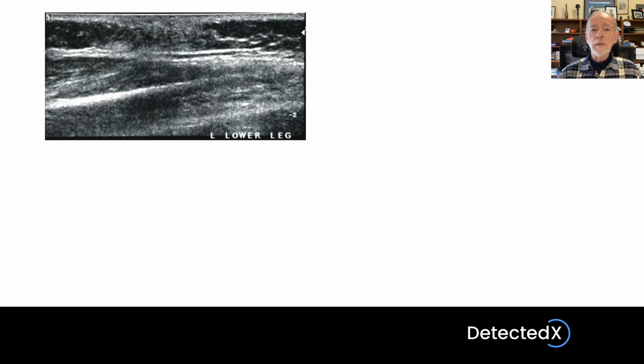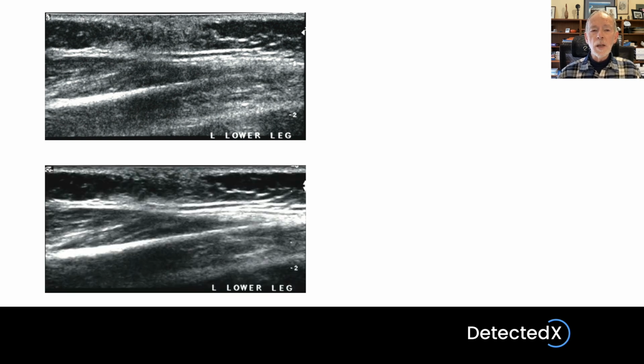Here is an image of a leg. The upper image is a conventional or simple scan, and the lower image is the compound image. You'll notice in the compound image that the speckle is much less obvious, much less distracting, and also there is indeed a sense that the tissue boundaries and the tissue structures are more complete, and it's easier to figure them out. So there is improved clarity in the imaging of tissues, tissue boundaries, and reduction of speckle.